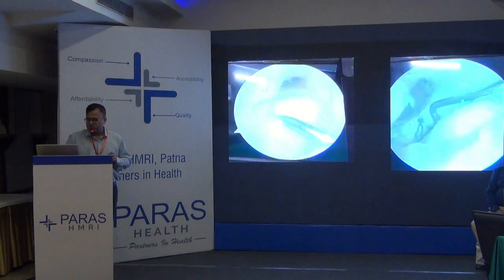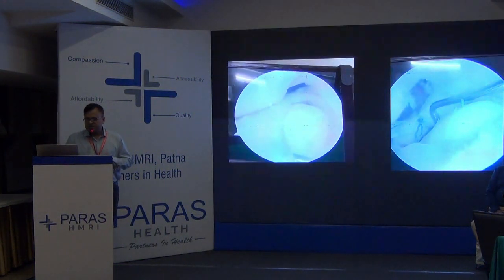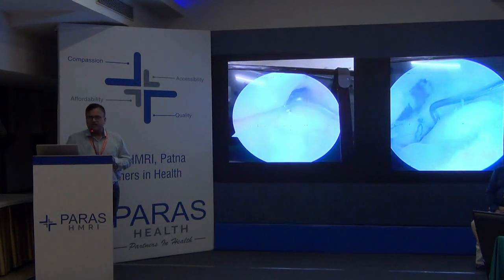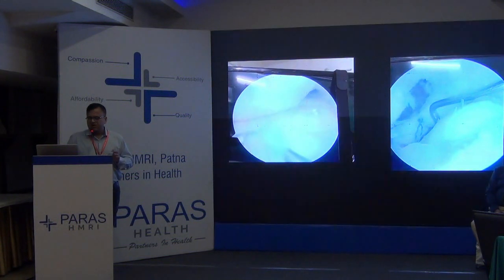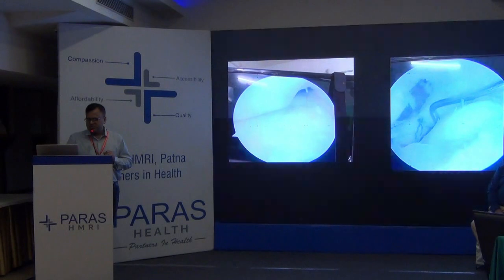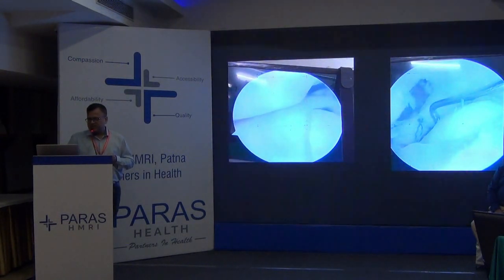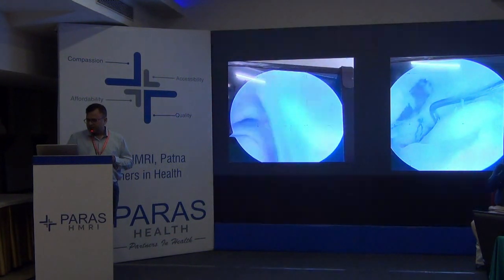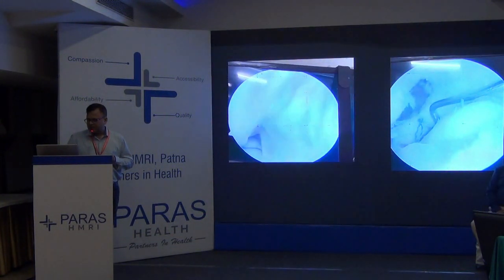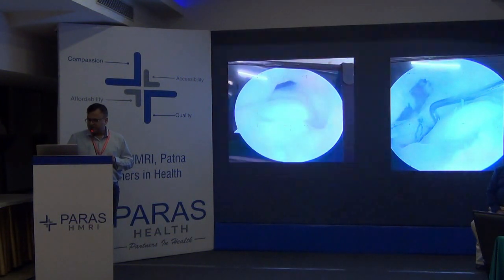But once I put the scope in his knee, you can see this is just the incomplete variety of the lateral discoid meniscus. So here we just do the saucerization and simultaneously do the repair, marginal repair of the saucerized part.